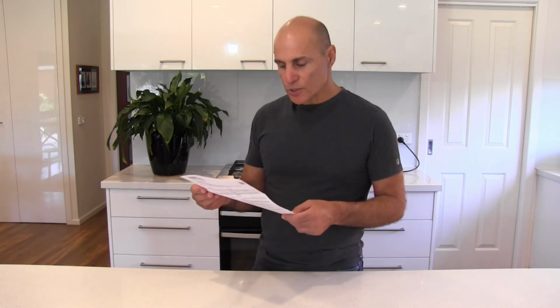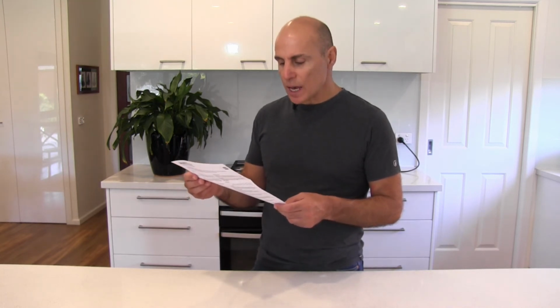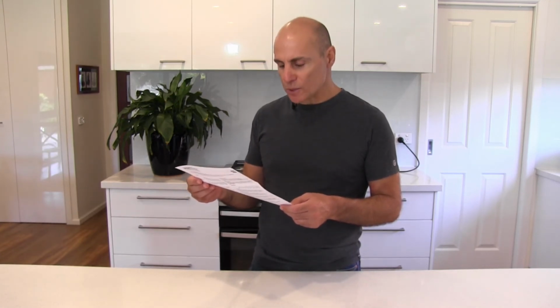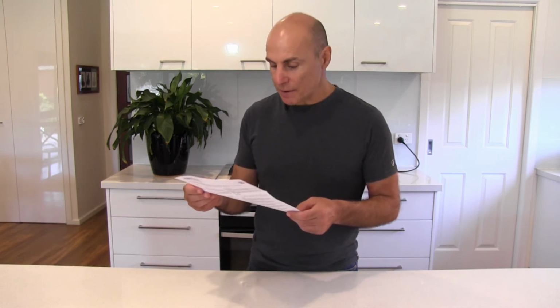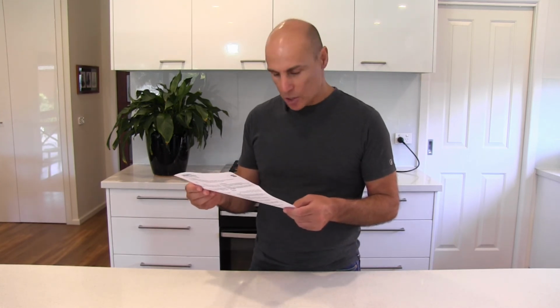It's now been about 3 weeks and I've received a letter. Dear Spiros, results notification. Thank you for taking part in the National Bowel Cancer Screening Program and returning your test kit. We are pleased to advise that the result of your fecal occult blood test was negative. This means that no blood was found in your samples and no further action is needed for now. However, this does not mean that you do not have or can never develop bowel cancer, as some bowel cancers do not bleed or only bleed on and off. This is why it is important to screen every 2 years, and on it goes. If I had tested positive, then I would obviously have to consult a doctor.